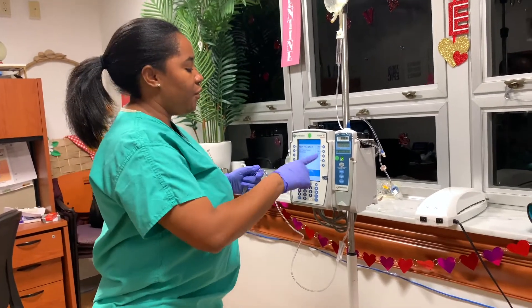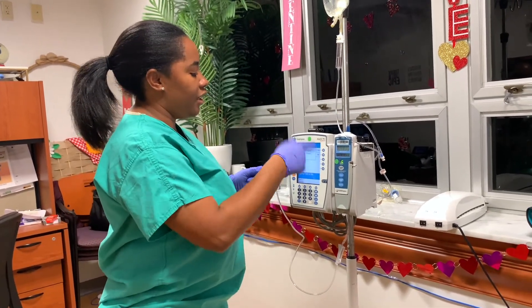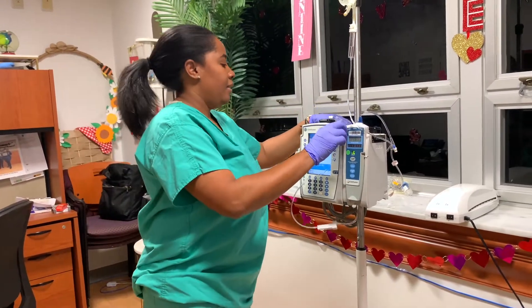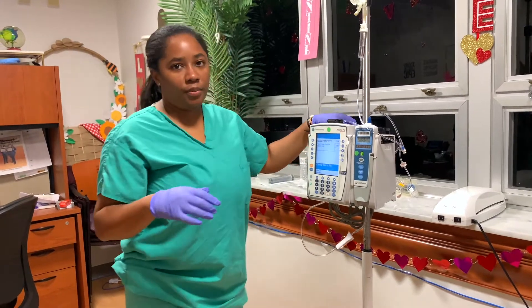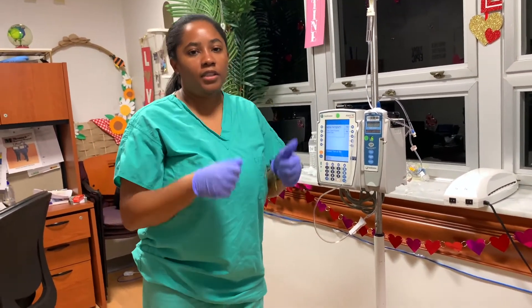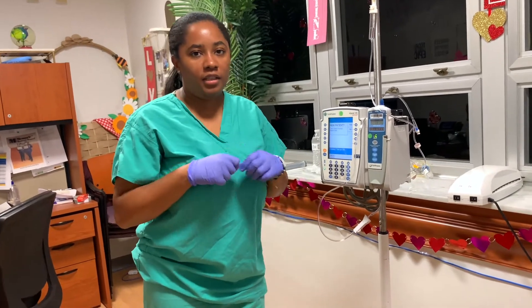If it's a new patient we're going to put 'new patient'; if not, we're going to continue with the same patient. So this is how you will be priming for the primary line. And of course this is going to be attached to your patient after you clean — you always want to make sure that you're cleaning the hub for at least 30 seconds before you attach any solutions.